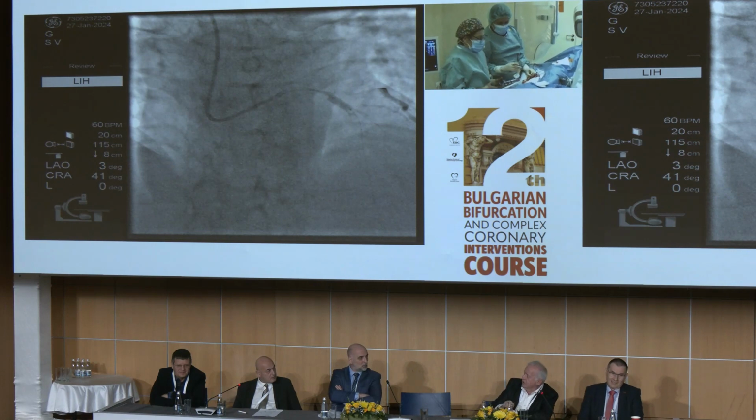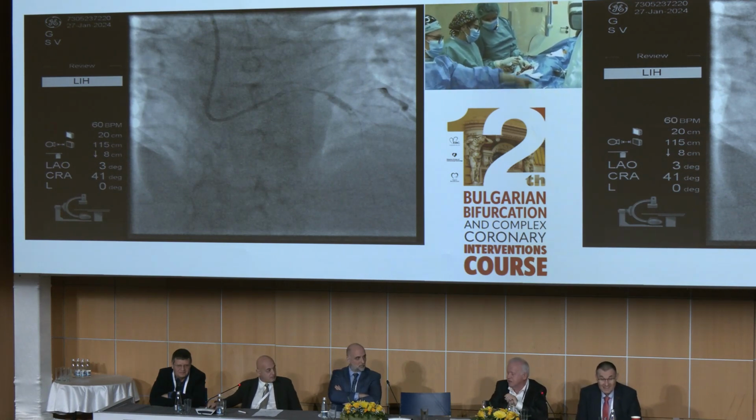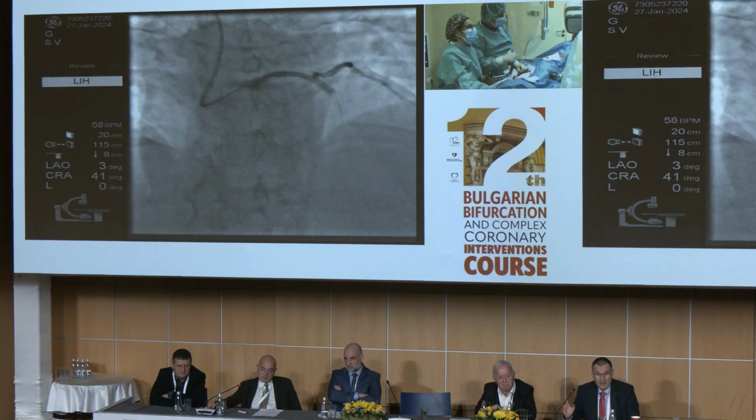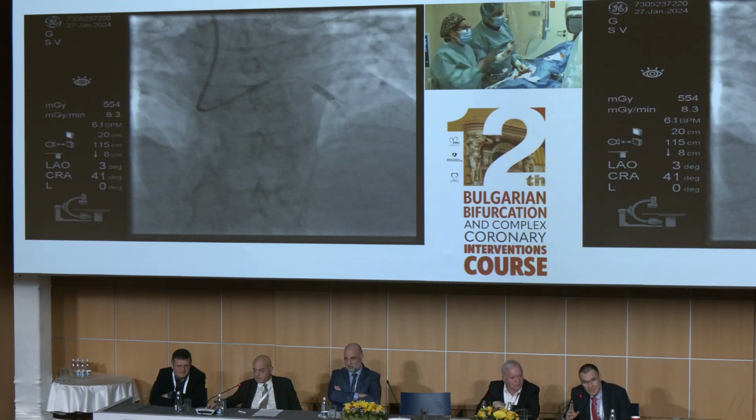Okay, of course, let's go. During that time, you can discuss your vacation. Let's go to 12. It's a bit longer, but it will add 2, 3, 4 minutes to the procedure. Unfortunately, the contrast still penetrates behind the balloon.